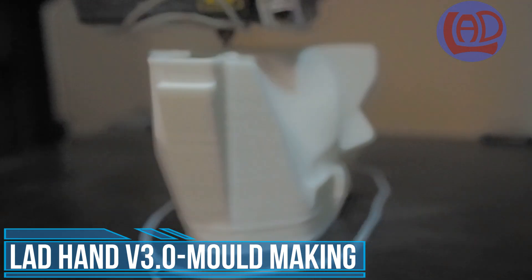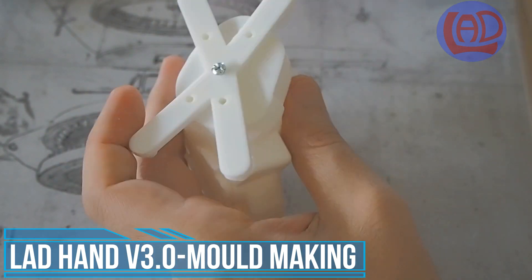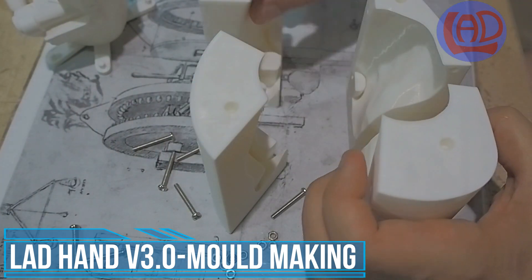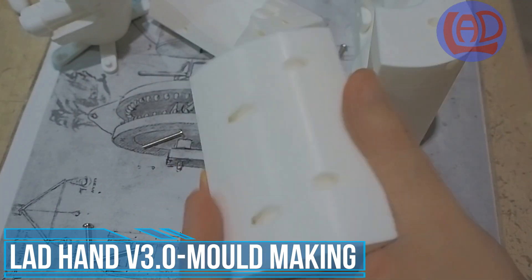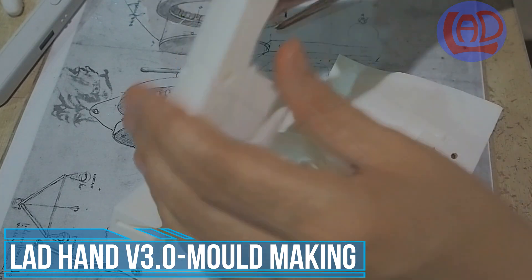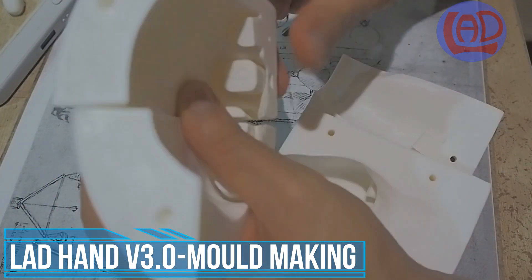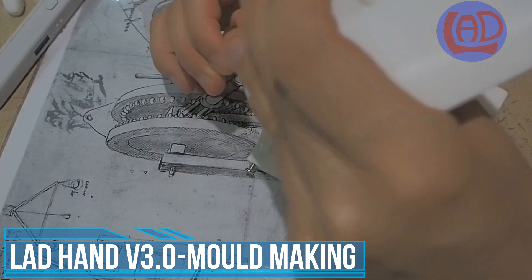The mold is composed of an inner core with the size and shape that includes the internal mechanism of the hand. The main body of the mold is an outer shell with the external shape of the hand divided in four segments to facilitate the demolding of the rubber skin. All of these components have been 3D printed and assembled together using bolts and nuts.